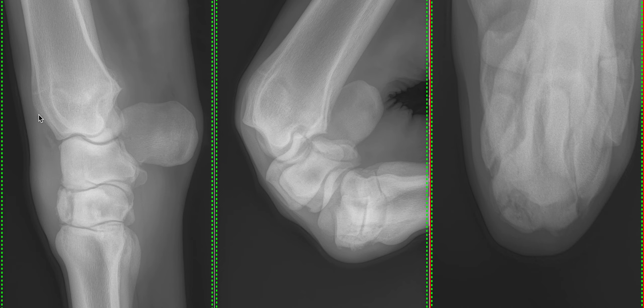On the screen at the moment, to the left we have a lateral medial view of the carpus, a flexed lateral medial view in the centre, and a dorsoproximal-dorsodistal oblique view, which was taken at 35 degrees in order to highlight the third carpal bone, which is this bone here. This isn't a complete view, and we're going to talk about the other views in a minute.